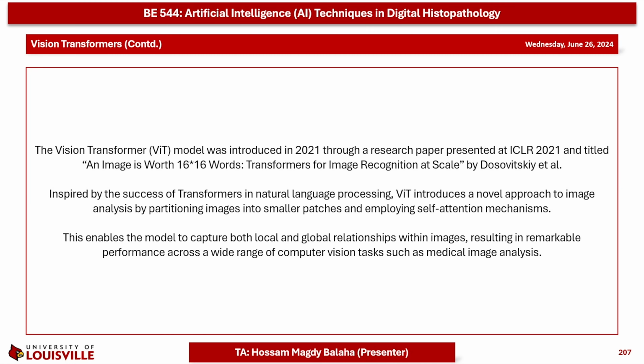Vision transformers took that concept and introduced it in a novel approach to image analysis by simply partitioning images into smaller patches and employing self-attention mechanisms. So instead of dealing with the image as a whole, we are dealing with images as smaller patches. And as noted, in natural language processing we are dealing with words or vectors, so images are converted into vectors to be used with a self-attention mechanism.